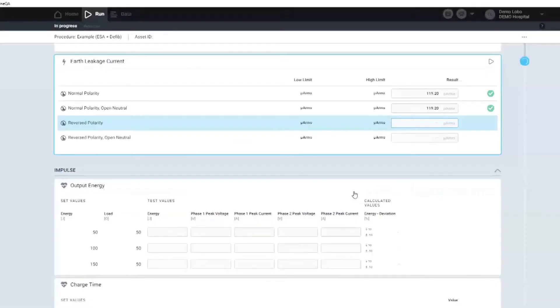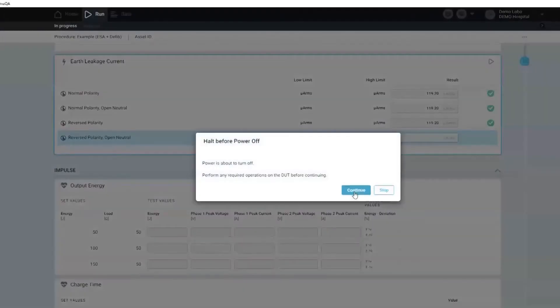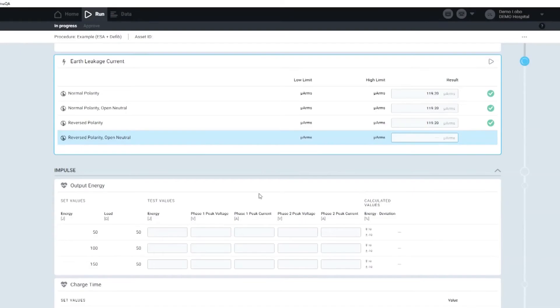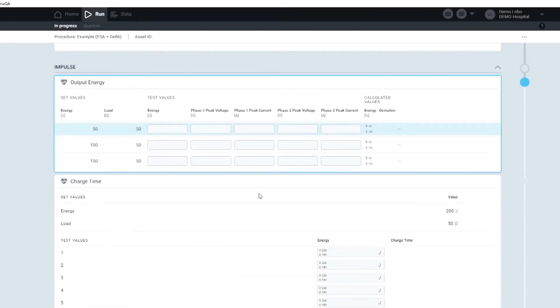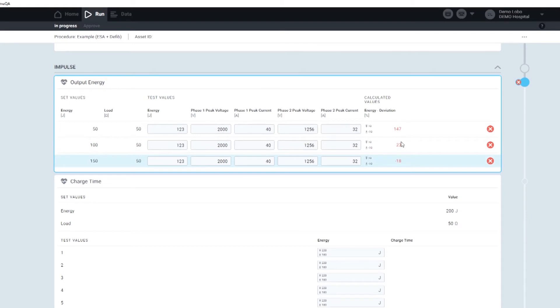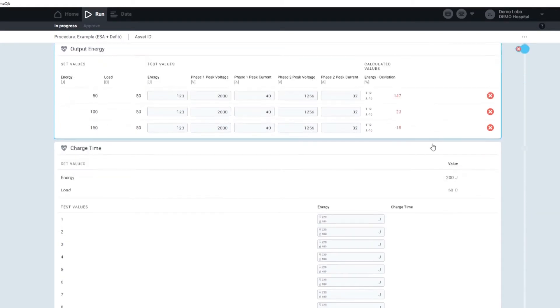As you can see now, I'm changing to impulse testing. Over here, you will see the fail sign as it does not go through the correct limits.